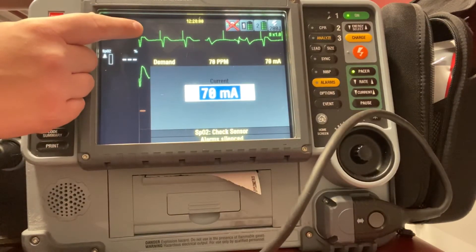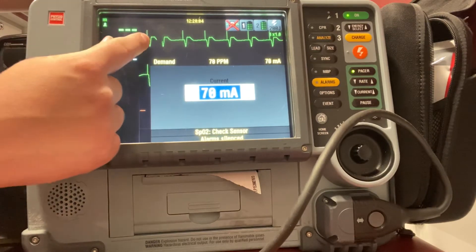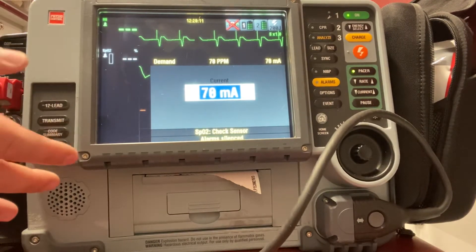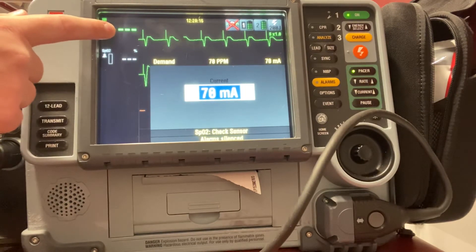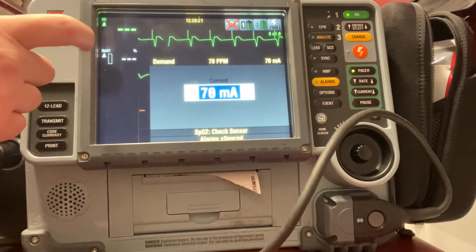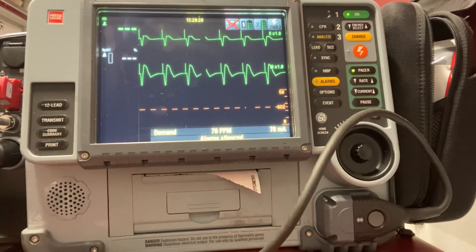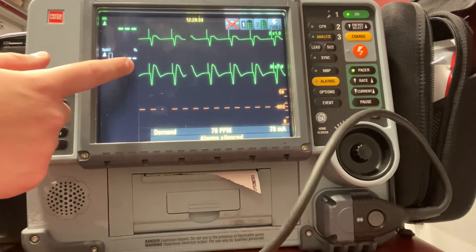You can see right here I have electrical capture — see how my spikes now match up with my QRS complex. I should also be able to feel a mechanical pulse on my patient with that pacing. Seeing it on the monitor is called electrical capture, meaning the monitor is showing that we have capture and the heart rate has been raised. But really the best way to make sure this is working for my patient is to feel for that mechanical capture — I want to actually feel a pulse on my patient and see if it coincides with the pulse on my monitor, which should be 70 beats per minute.